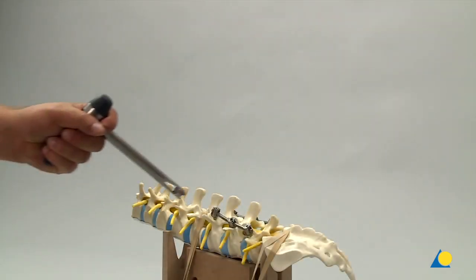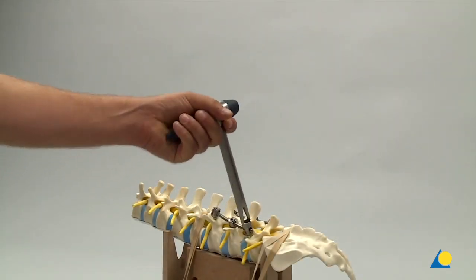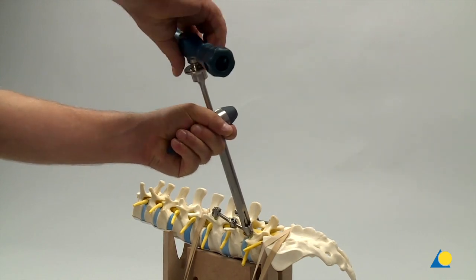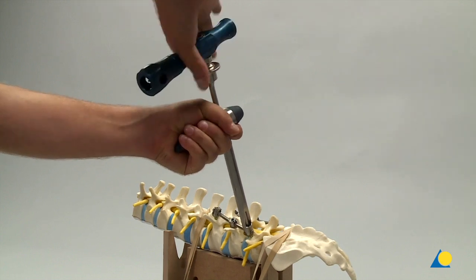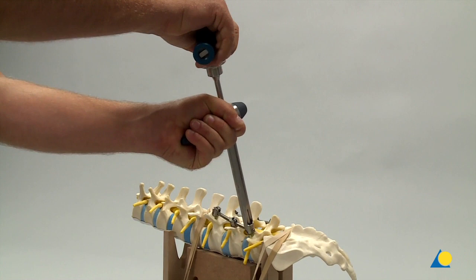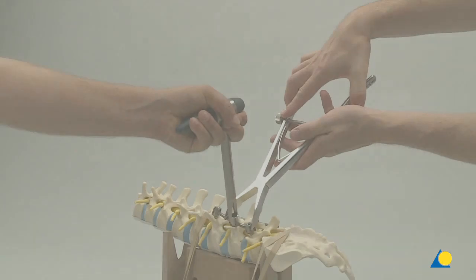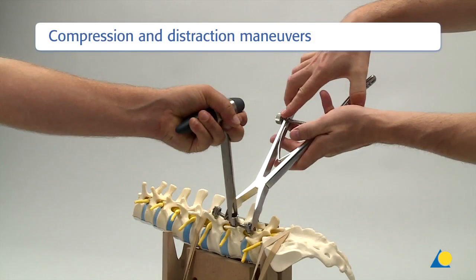The single INIs are fully tightened using the tightening instruments assembly. The shaft is inserted through the rod stabilizer into the single INI. The T-handle is rotated clockwise until it clicks and resistance is no longer evident. Once the rod has been captured into all of the polyaxial screw heads, compression and distraction maneuvers can be easily accomplished by loosening the single INI, performing the maneuver, and re-tightening.